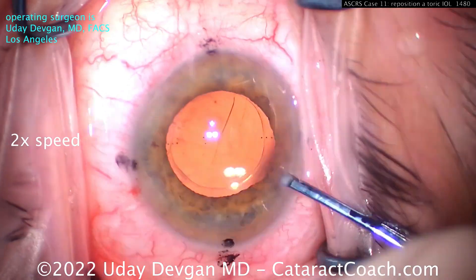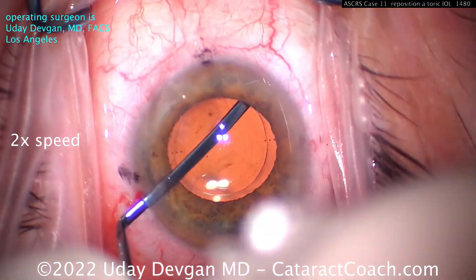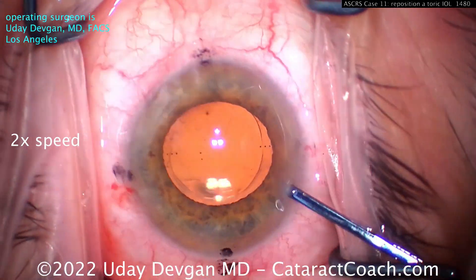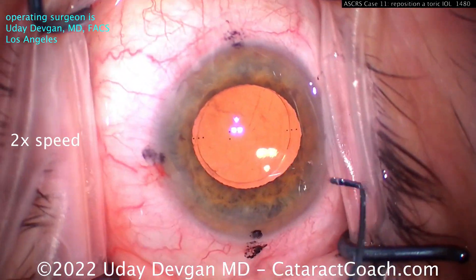Bevel down, you'll notice. Now we'll go in with the spatula and help open up that area, create a little bit of a gap. We can get that around 360 degrees, using the two paracenteses opposite each other to get full access.